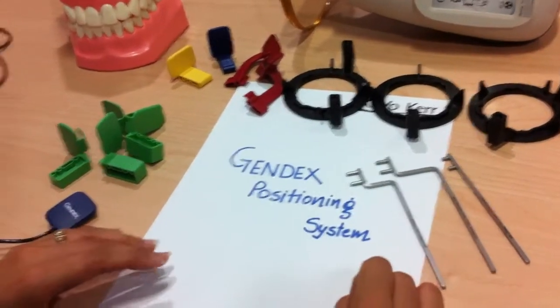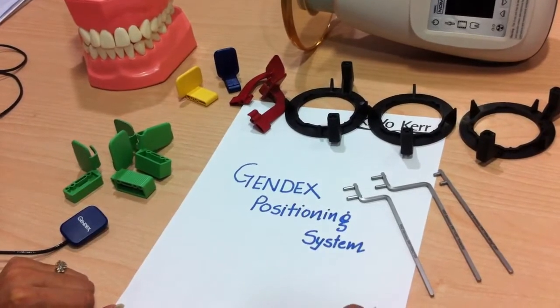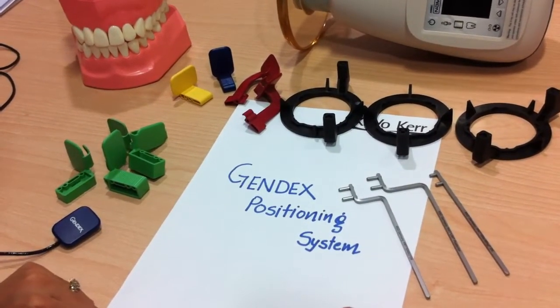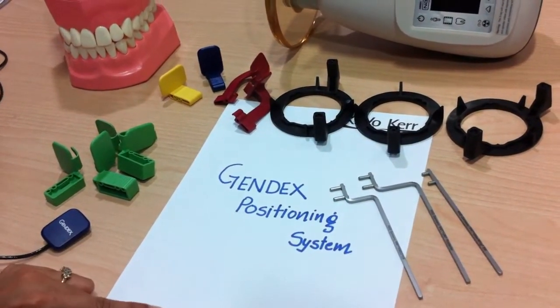This module will illustrate simple positioning techniques that will allow you to capture distortion-free radiographs every time. Let us start with understanding the tools or the parts available in the positioning kit.